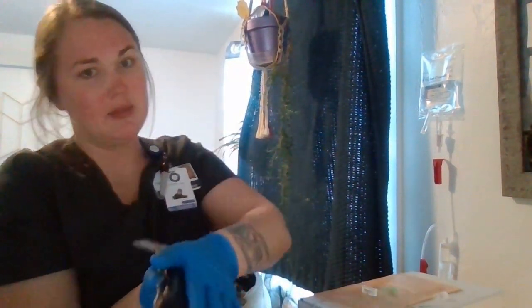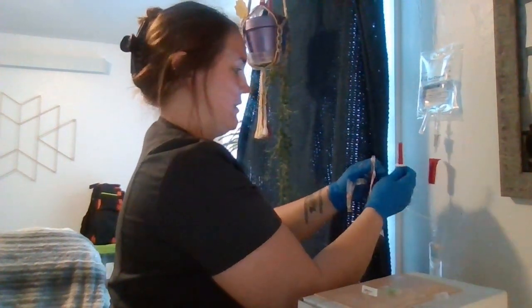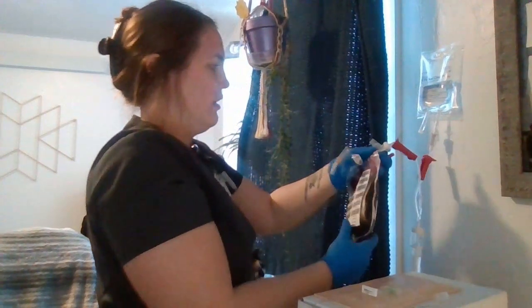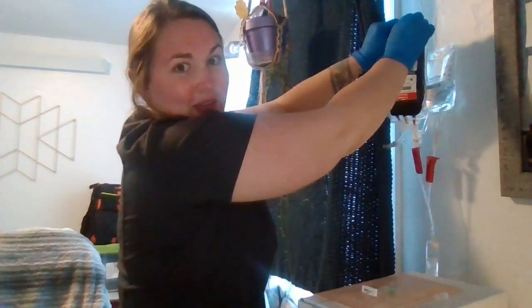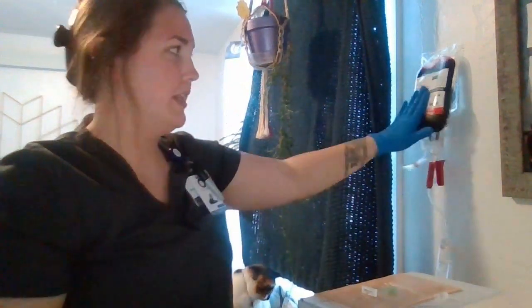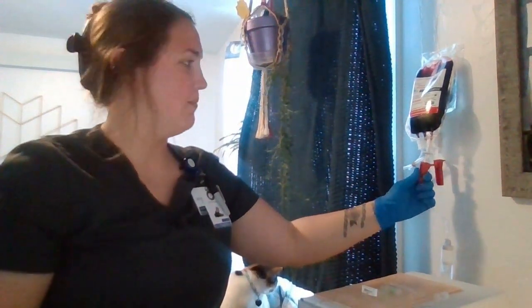I'm going to get my blood and I'm not going to shake it — I'm just going to invert it so that I mix the plasma and the cells. Once I've done that, I can go ahead and spike my blood bag with this spike, making sure I use aseptic technique. Then I'm going to hang this on my IV pole. Once I've hung it on the IV pole with the saline, I can then open the clamp by the blood bag.